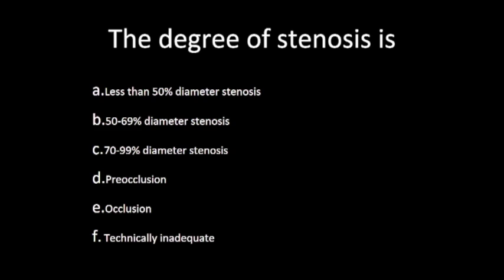Measure the length of the shadow. You've obviously heard this lecture from Dr. Pollack, where he claims that the length of the shadow is related to the accuracy of the ultrasound. I heard that lecture, and I've been looking at that myself, and much as I love Dr. Pollack, I have not been able to confirm his results. So, good thought, but not today. But it's not a bad idea.